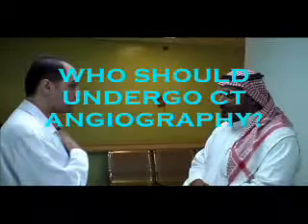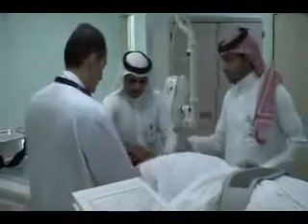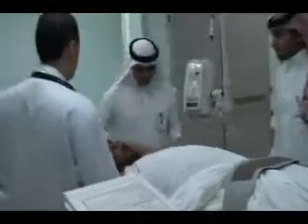Who should undergo CT angiography? Patients who have intermediate or high-risk profiles for coronary artery disease, but who do not have typical symptoms, should undergo computed tomography angiography.